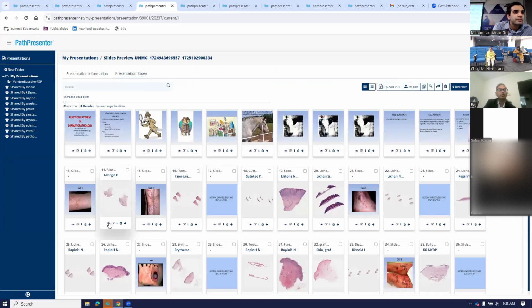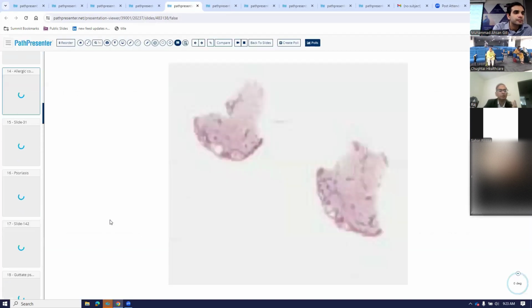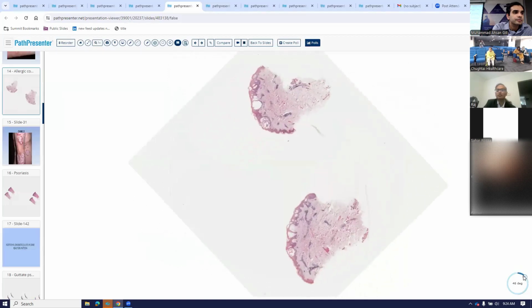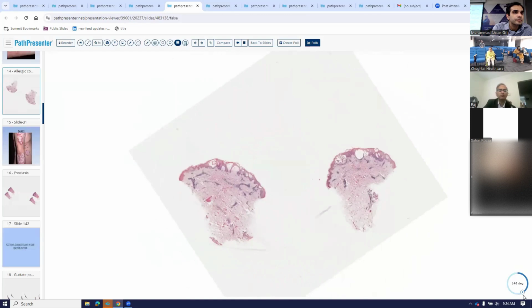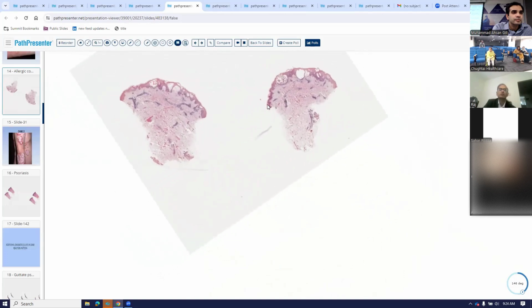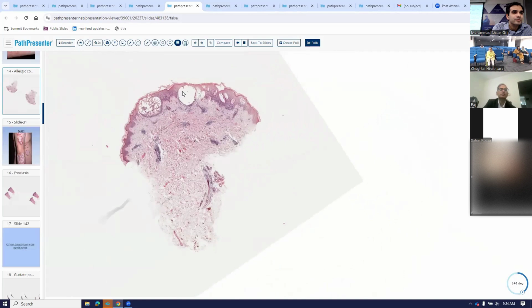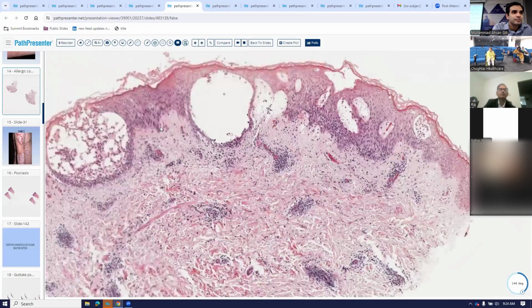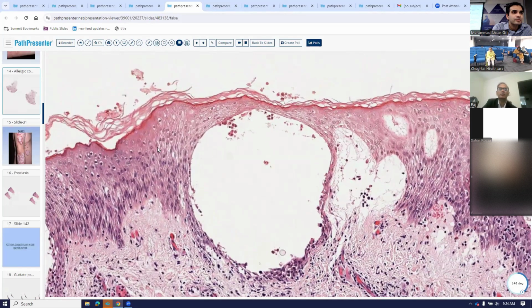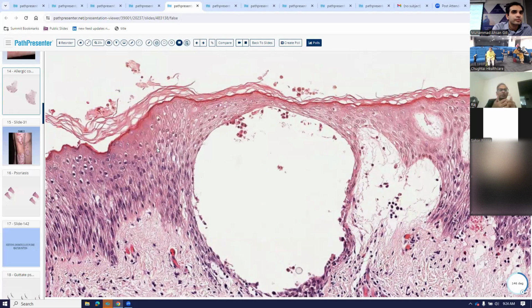So remember when we talked about spongiosis, what does spongiosis mean basically? Again, always go back to the pathophysiology. Spongiosis means it is edema of the epidermis. And what does edema mean? Edema means collection of fluid. So what does the collection of fluid do basically? The collection of fluid causes the separation of the keratinocytes. When you look at these keratinocytes, you start seeing increased spaces between them. So they start a little bit separating out basically. When this becomes extreme, then you start seeing this big space that is filled with fluid, and that is what is termed vesiculation.